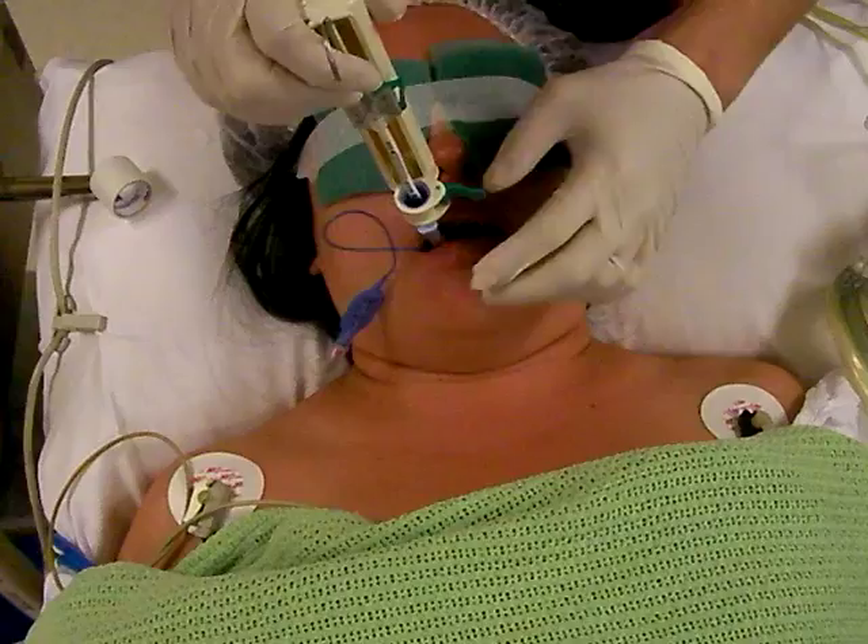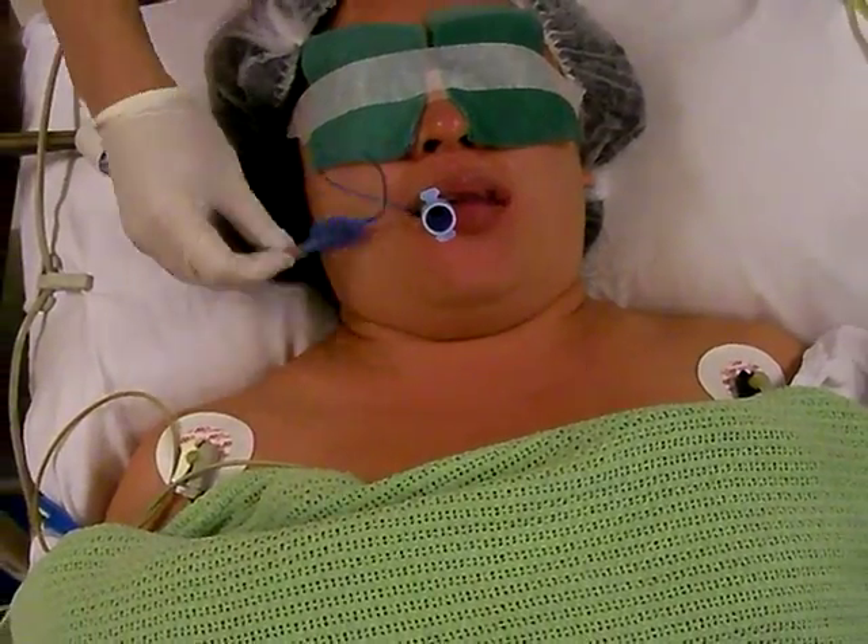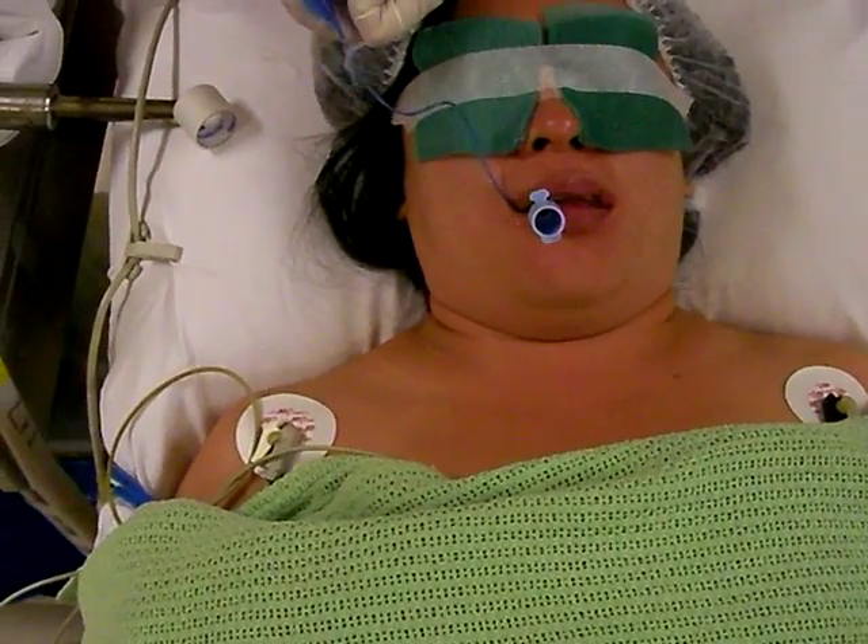At last, you unclamp it and take it out in one piece. Now you can inflate the cuff balloon as usual and connect it to your ventilator.